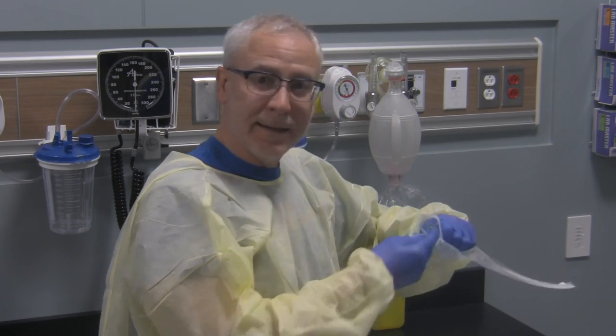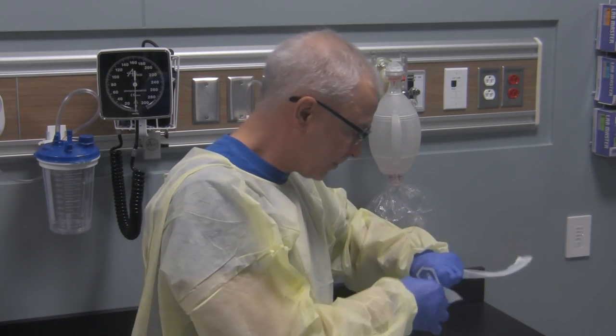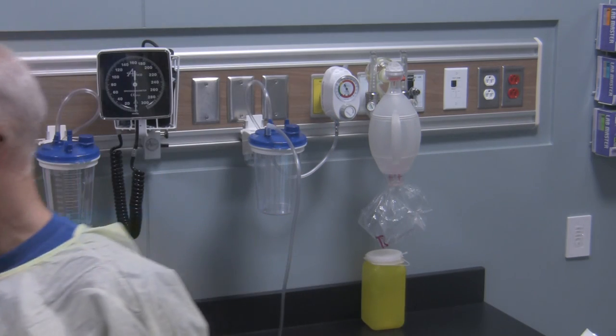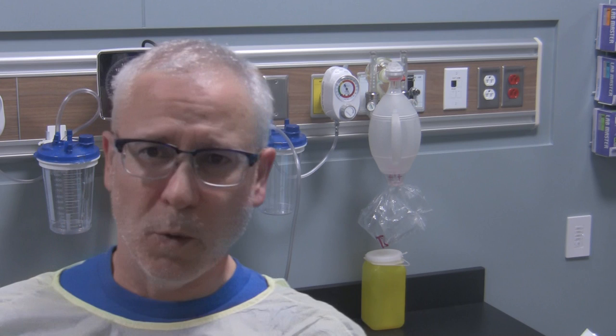Who would have known that doing this causes you to tear up — but it just goes to show you need to have some empathy for your patients. When I stuck that suction catheter back there I could feel it go all the way to the back of my oropharynx and into the hypopharyngeal area, where it started to irritate and produce a gag reflex. Let's try this again.